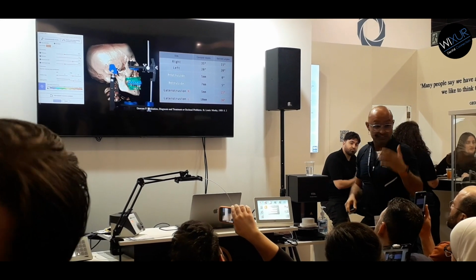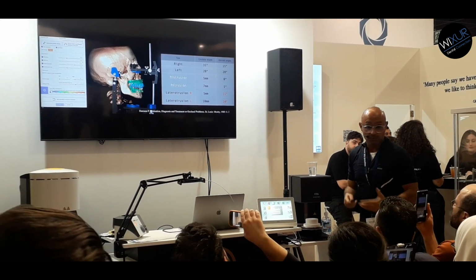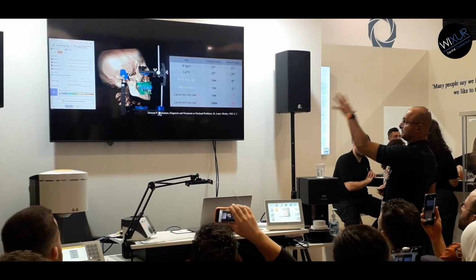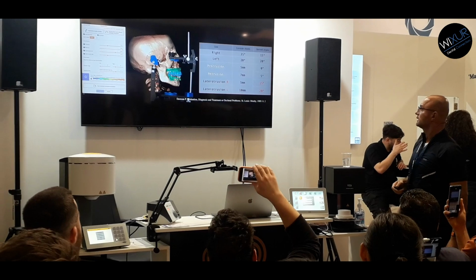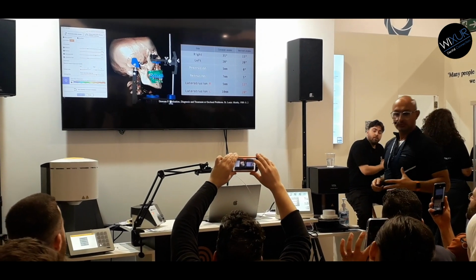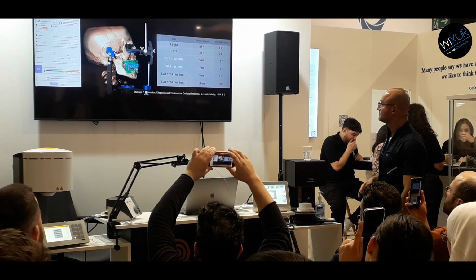And we are going to test drive it by using the provisionals. Otherwise, this is just a theory. We should test it in the mouth. The most important picture of the day today, guys, because this makes sure your restoration goes for another 20 years.